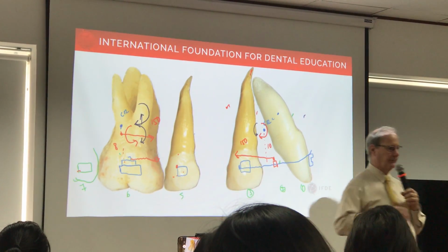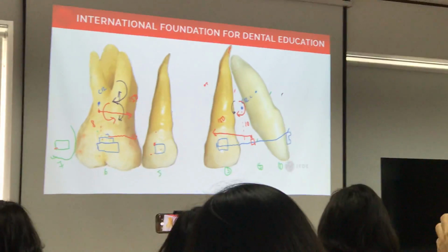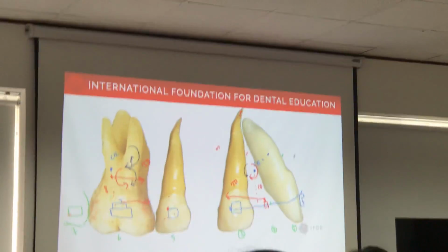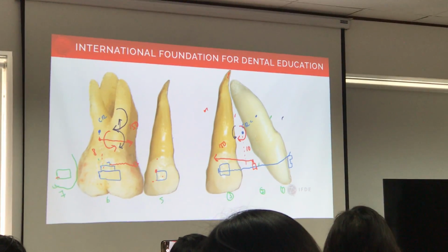Như vậy thì thầy nói là cái sự đa dạng ở trong lâm sàng nó rất là nhiều. Nó có thể là cái răng nó ngửa ở các cái mức độ khác nhau và nó trồi các mức độ khác nhau. Thì mỗi một cái kiểu như thế là đều phải có một cái hệ thống lực tương ứng, nhưng mà thầy không thể nào nói hết được.